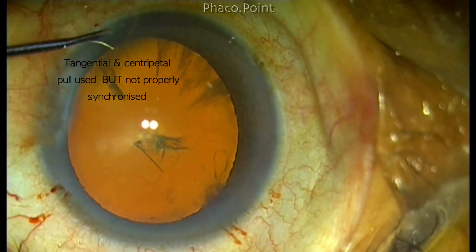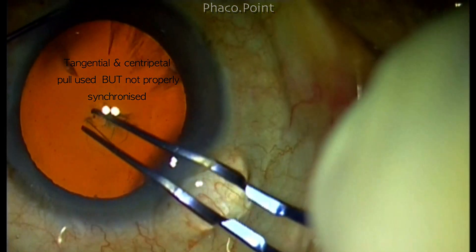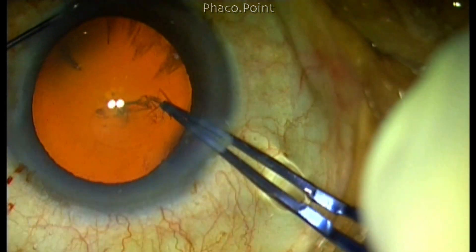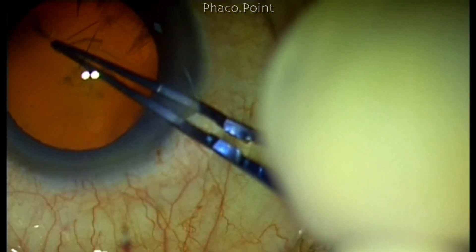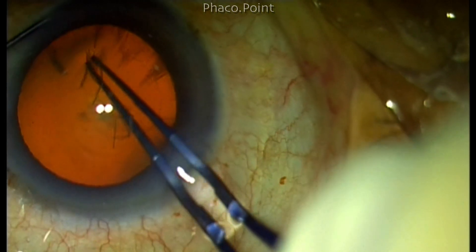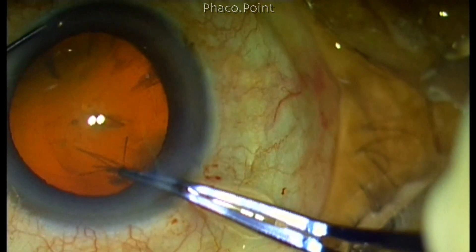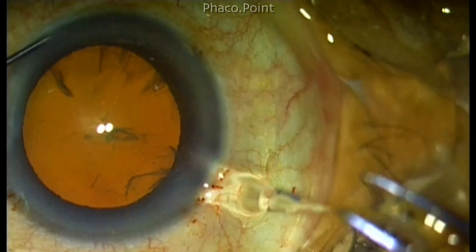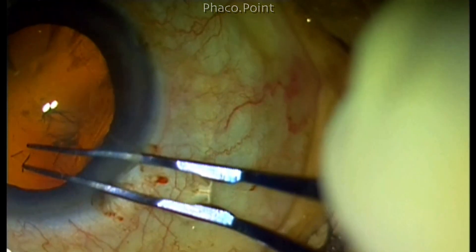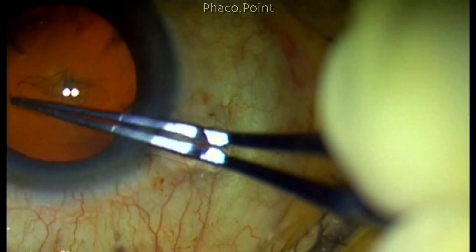Using a forceps in this case, you will notice a combination of tangential and centripetal force. From this point onwards, I'm trying to tear the capsule in an almost tangential fashion, and you see that it is very difficult because you need to re-grasp it many times to control the tear tangentially. Some amount of centripetal pull was finally needed to complete the rhexis.